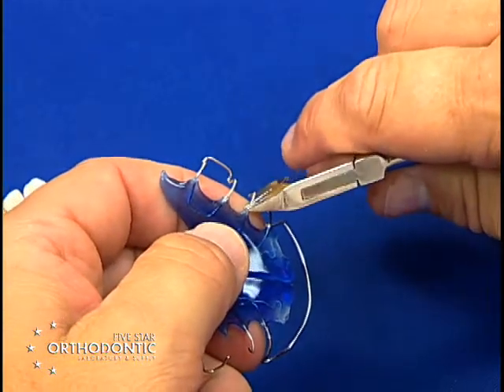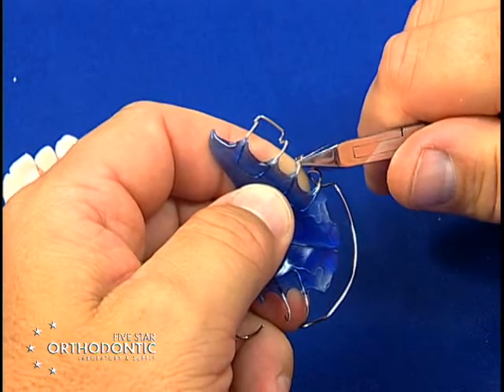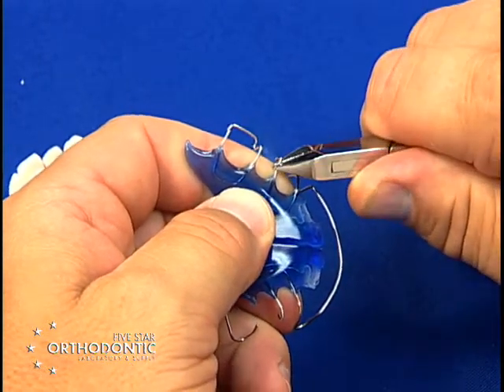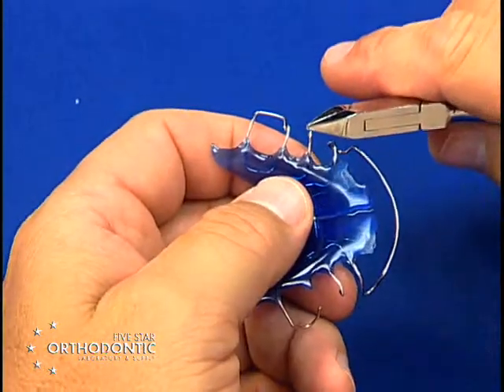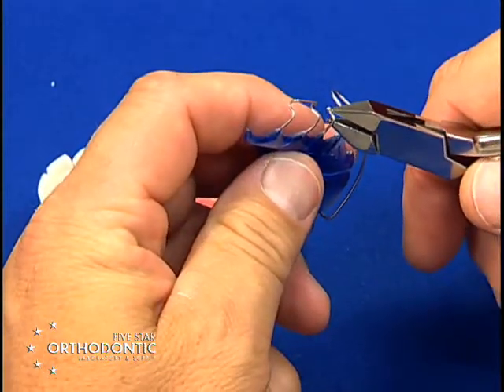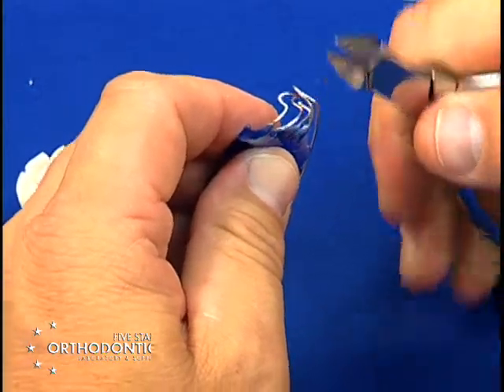Take the ball clasp right next to the acrylic, turn down toward the occlusion, then come away from the acrylic about two millimeters, place a dip bend — that will get the wire out of the occlusion but also take the buckle portion of the ball clasp away from buckle impingement, and basically turn it toward the tissue.